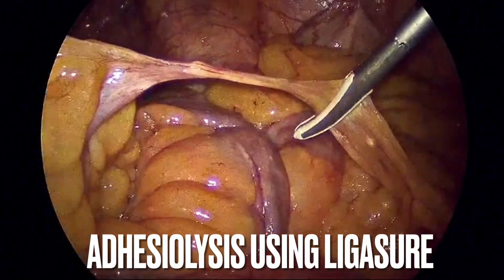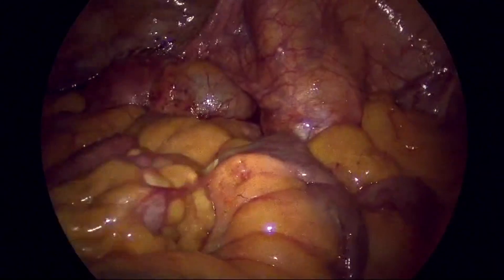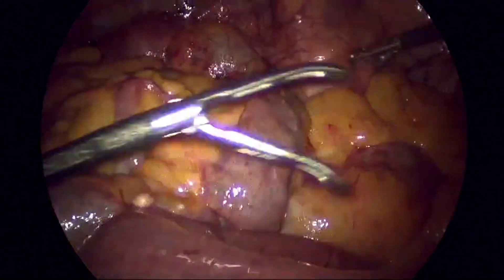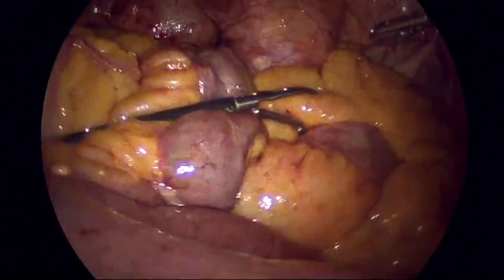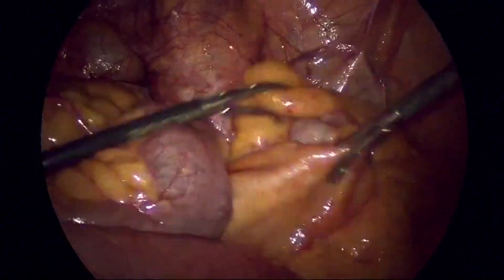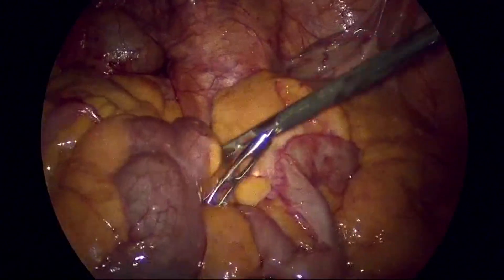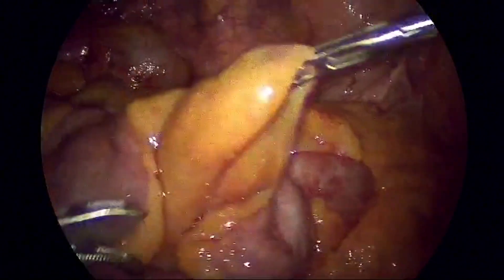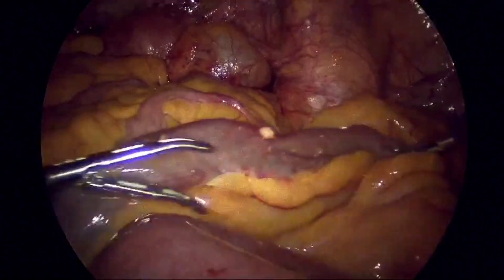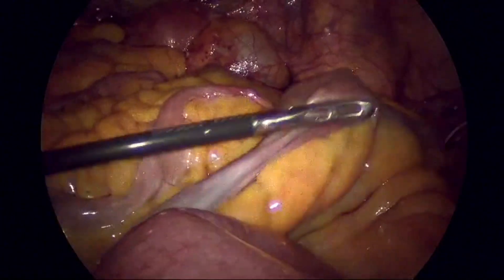With the help of a LigaSure, we did the division of the band. We can use a cold scissor also if you feel you are very close to the bowel. In this dilated system you should always be very careful handling the bowel, as you can injure it at any time.